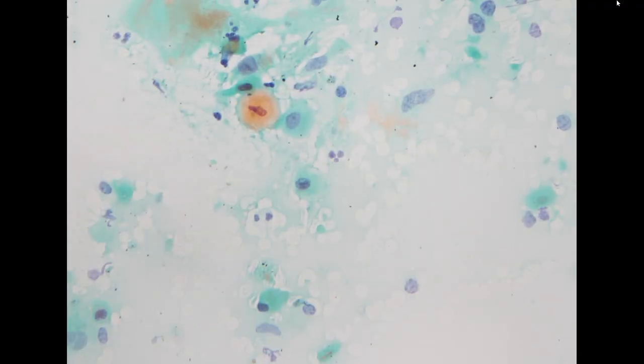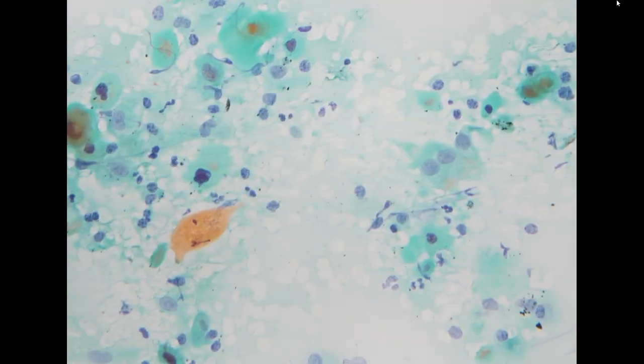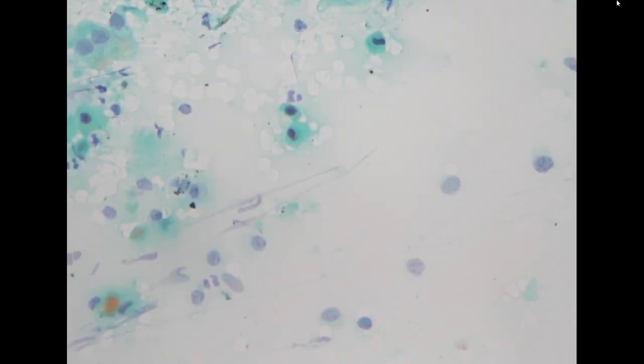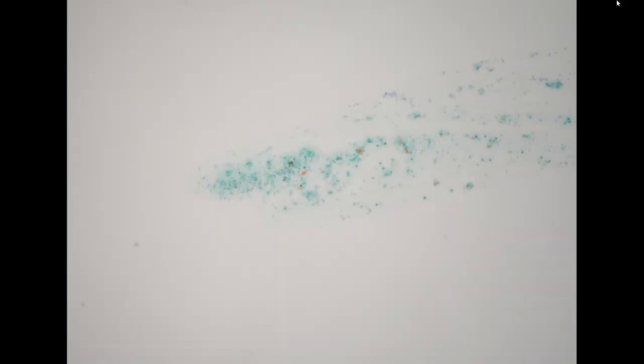So if it is a kidney mass with squamous differentiation, it would most likely be a high-grade urothelial carcinoma with squamous differentiation instead of a pure squamous cell carcinoma. So in this specimen, we call it non-small cell carcinoma with squamous differentiation. And the clinician needs to correlate with the primary site to see if it is coming from the kidney or if it is a primary lung disease.